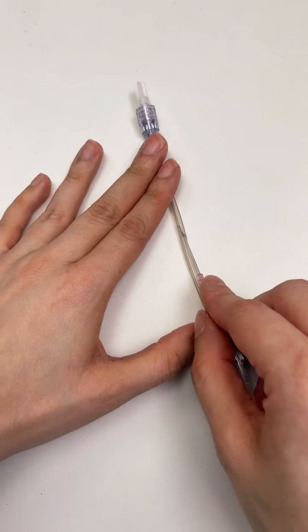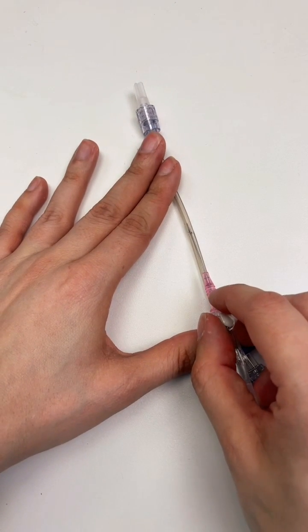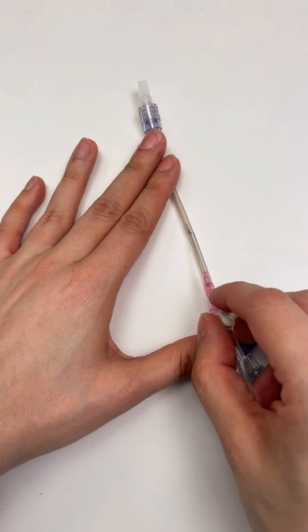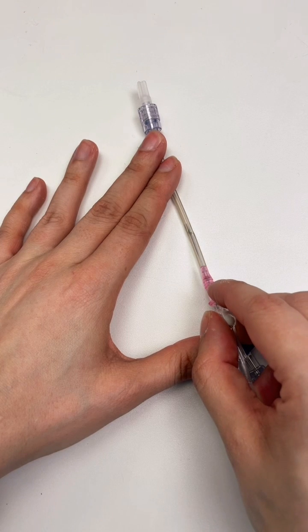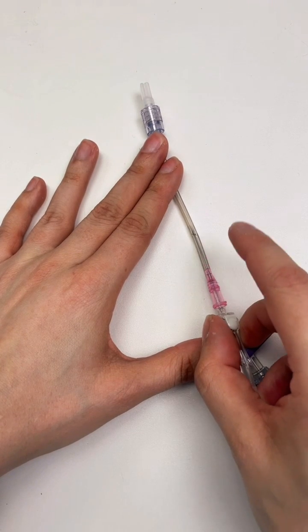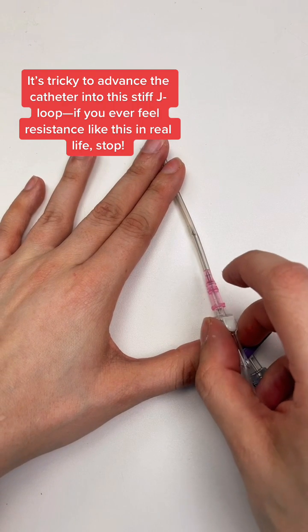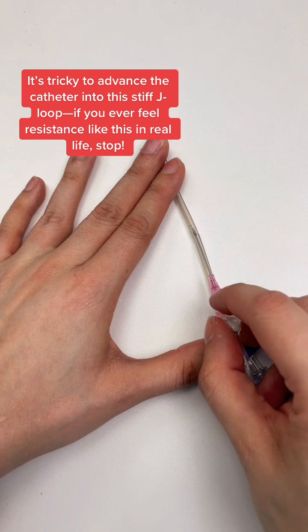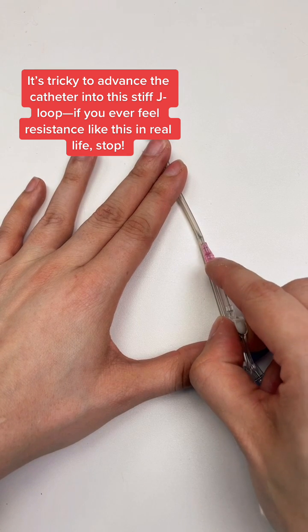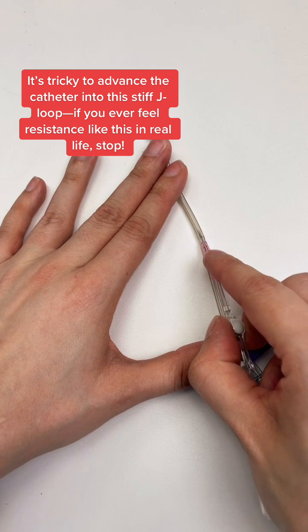The way that I showed in my last video, which is what you might be most comfortable seeing or what you see frequently in the hospital setting, is the one-handed advancement technique where you hold the needle or the stylet straight and steady and use your pointer finger to actually advance the catheter off of it and leave it in your patient's vein.